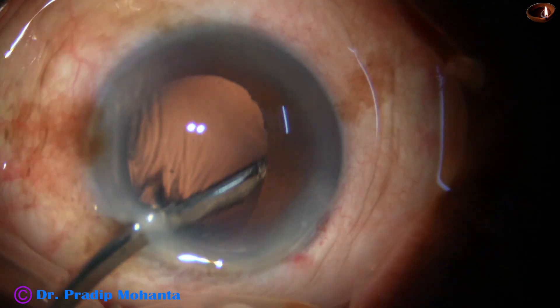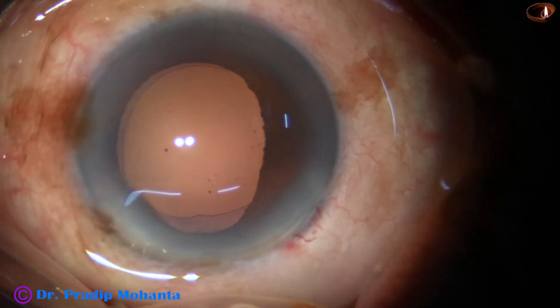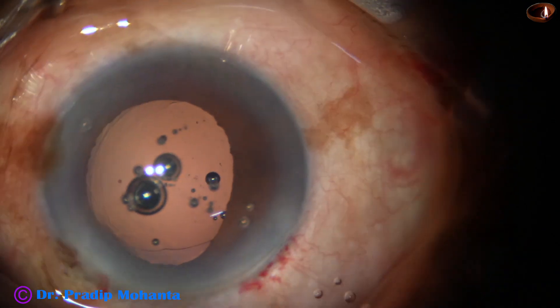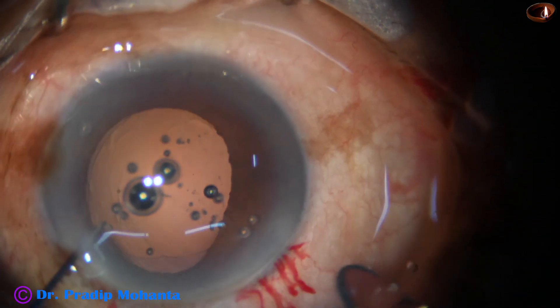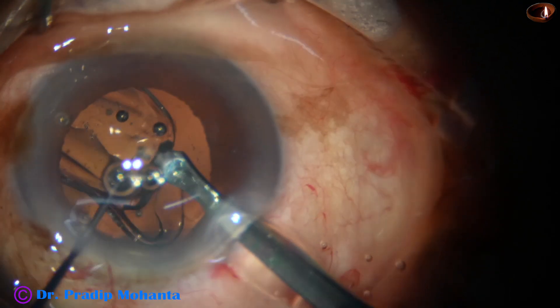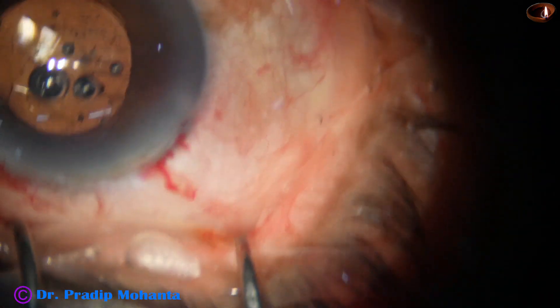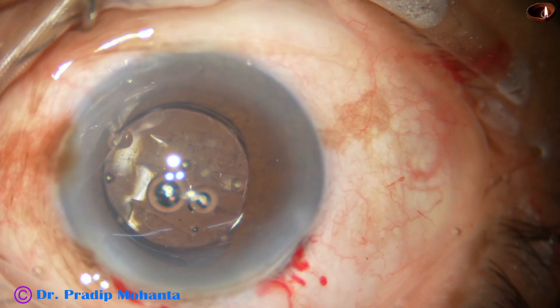The anterior chamber and the capsular bag are filled up with 2% hydroxypropyl methyl cellulose. Now is the time to implant an intraocular lens. This is a hydrophilic acrylic single-piece monofocal intraocular lens placed in the capsular bag. The lens is nicely placed in the capsular bag and a Sinskey hook is used to dial the lens.